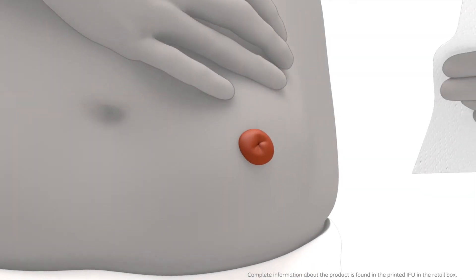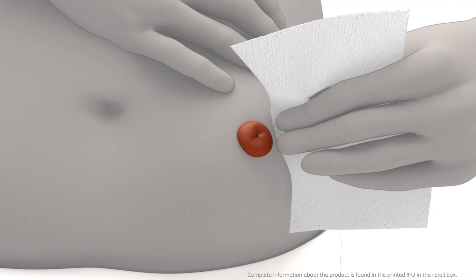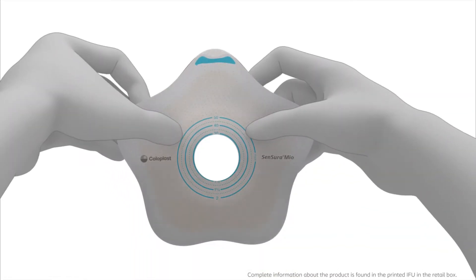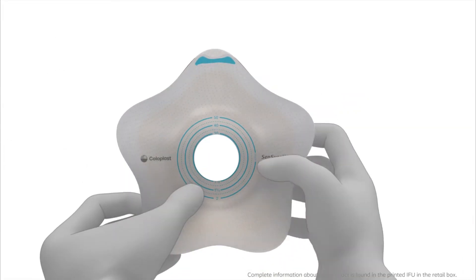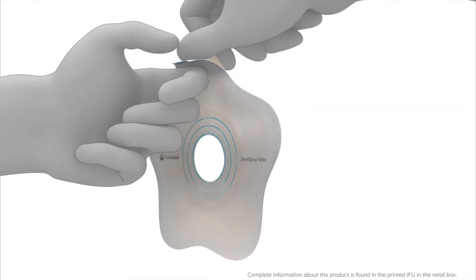Thoroughly clean the stoma and the surrounding skin area. The skin must be completely dry before applying the adhesive. Flip all five petals to prepare the adhesive for application and peel off the protective film from the adhesive.